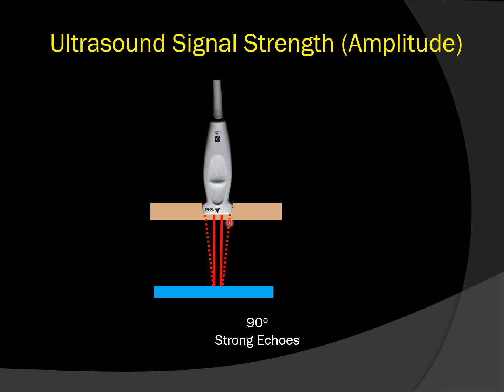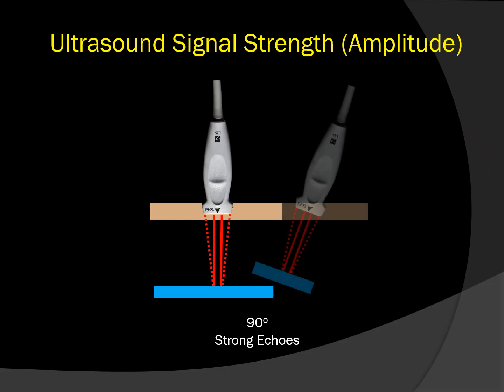So there are several factors which do play a big role in obtaining those sound waves. Most get lost. So to help control those sound waves, one of the important concepts is acoustic impedance. And acoustic impedance has to do with the differentiation between various materials, especially air and skin. So there is a large acoustic impedance between air and skin. And to cut that down, we have to use our friend gel. Gel drastically reduces the acoustic impedance, thereby allowing our sound waves to travel freely through the skin and into the structures below.